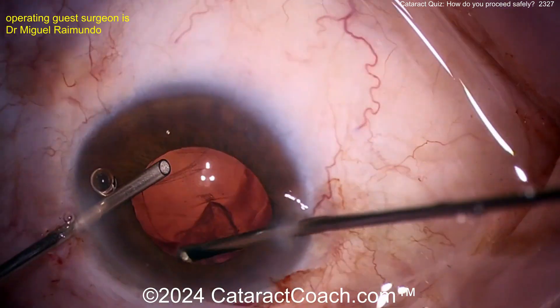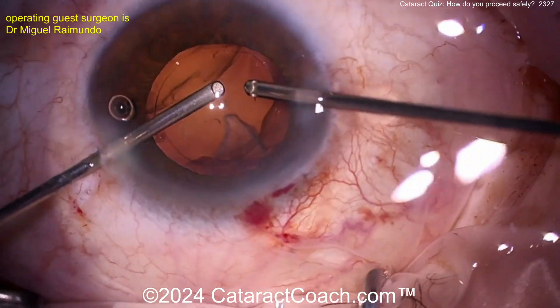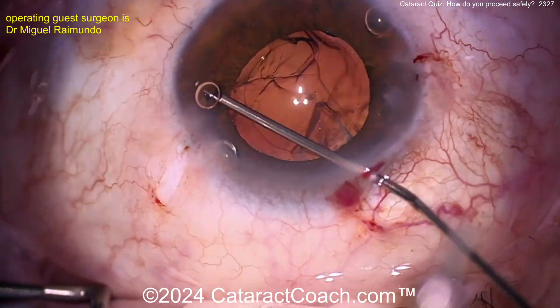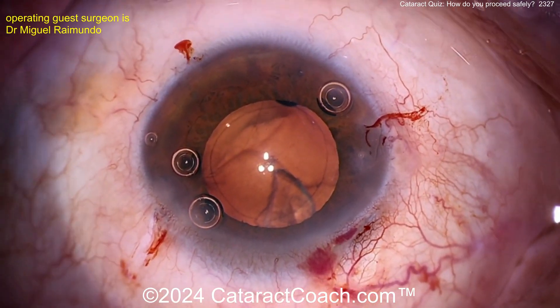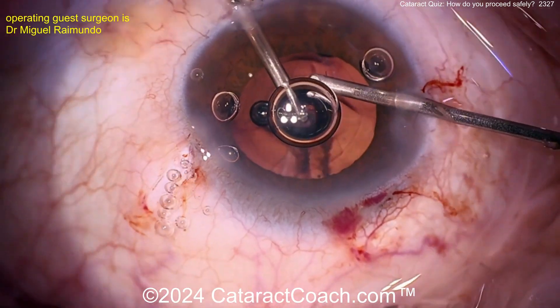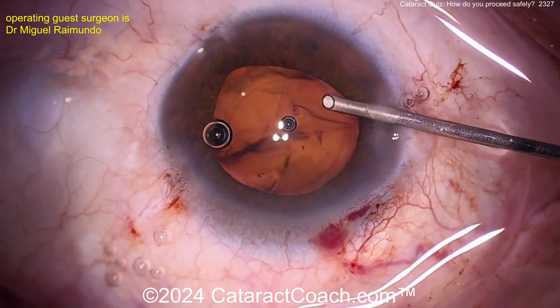A little bit of cutter going in at the break. If you hear your machine go ding-ding-ding, that's the sign of occlusion — engage the cutter in the area of capsule breakage. Triamcinolone is your friend here — a little preservative-free triamcinolone will stain the vitreous so you know where it is. More viscoelastic, a little bit of cortex remaining. Another paracentesis — great idea to get access from across. Use the cutter in I/A mode to aspirate that cortex. Extra paracentesis saves the day — beautiful, brilliant work.